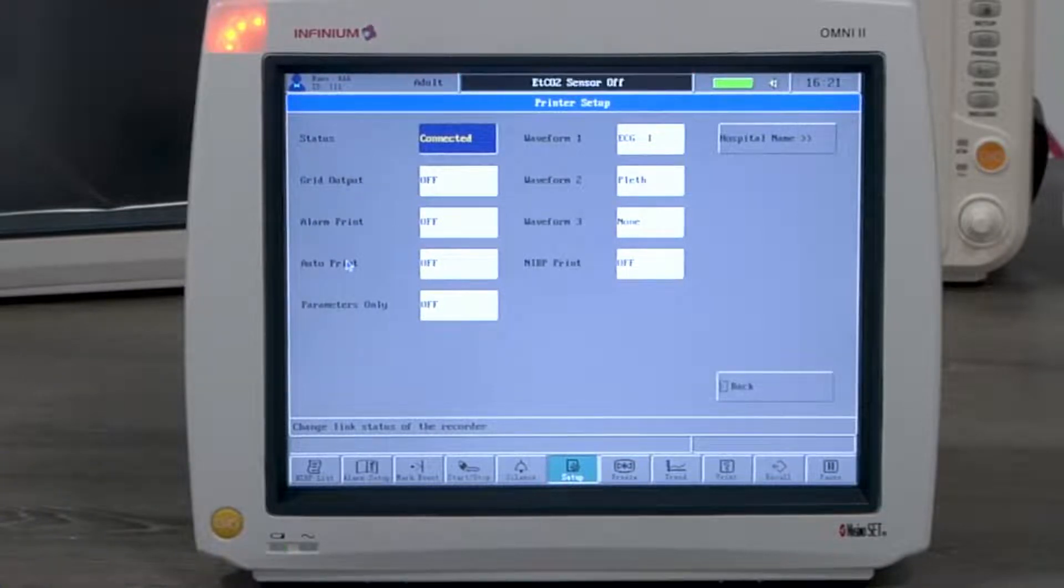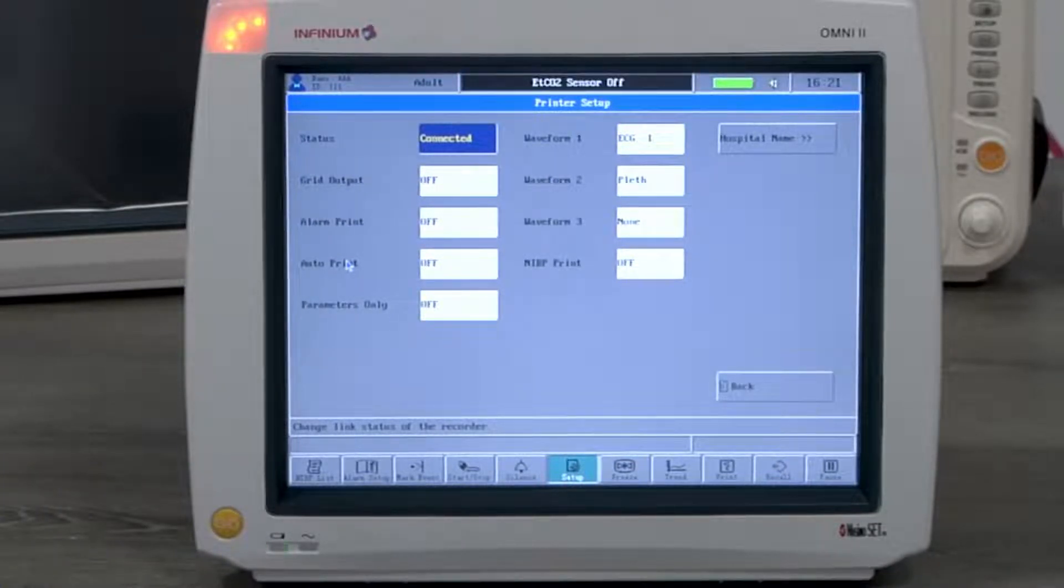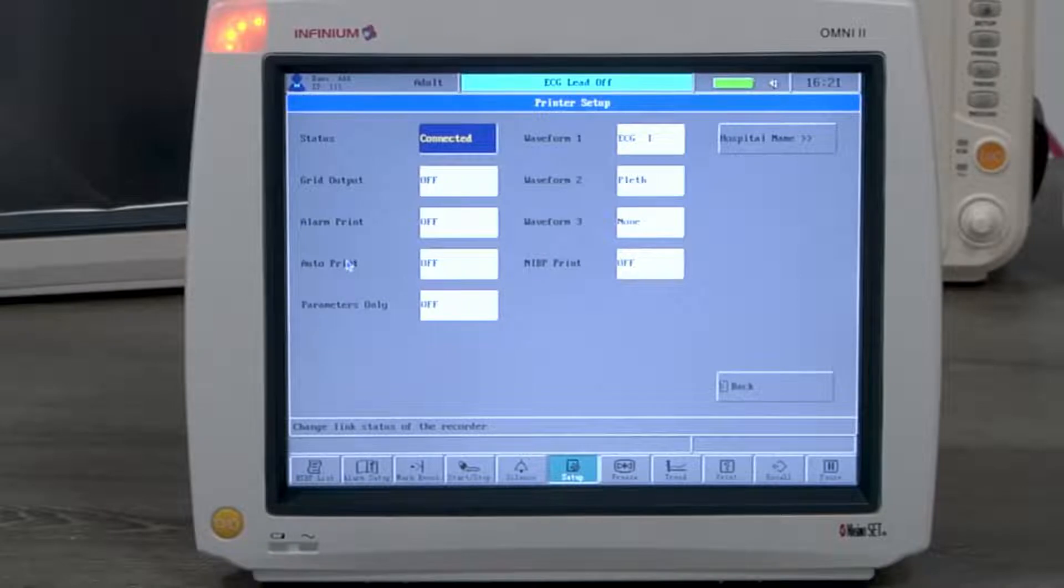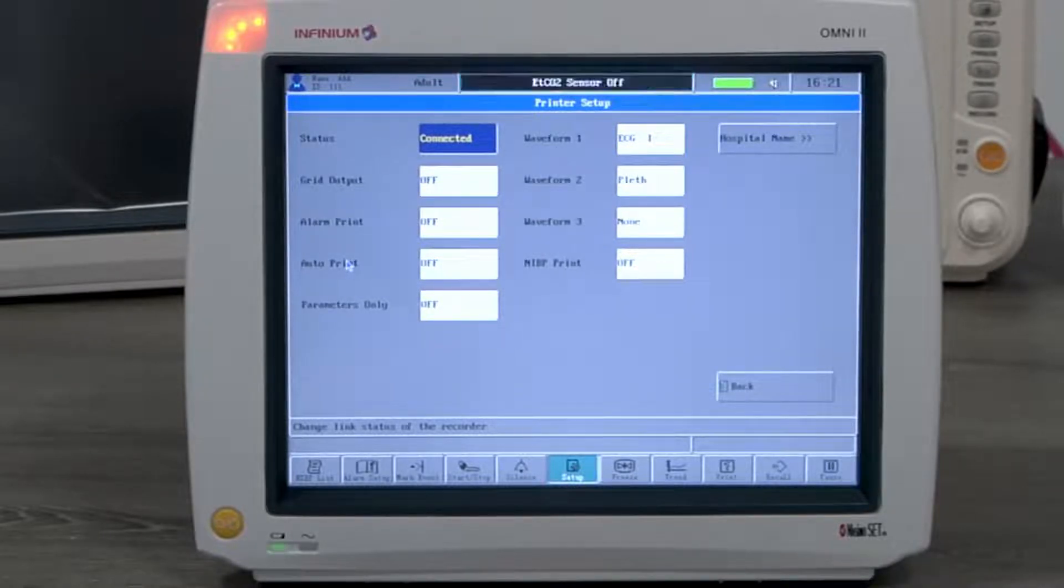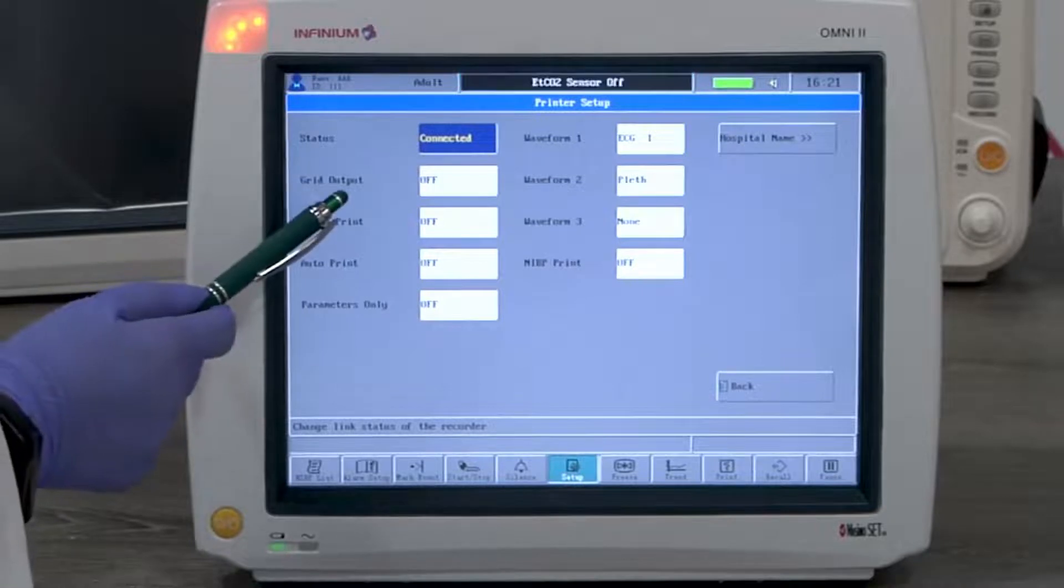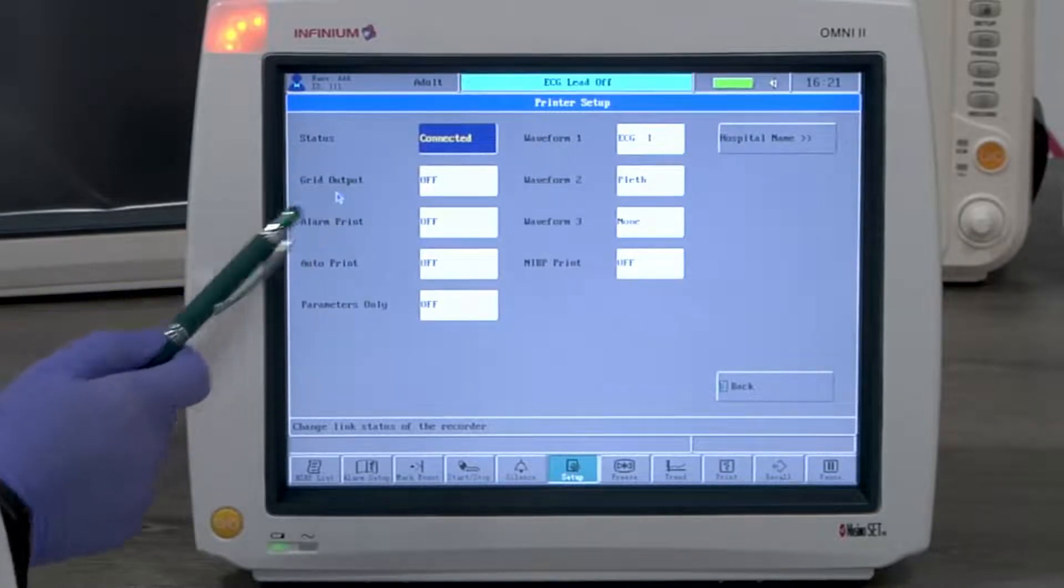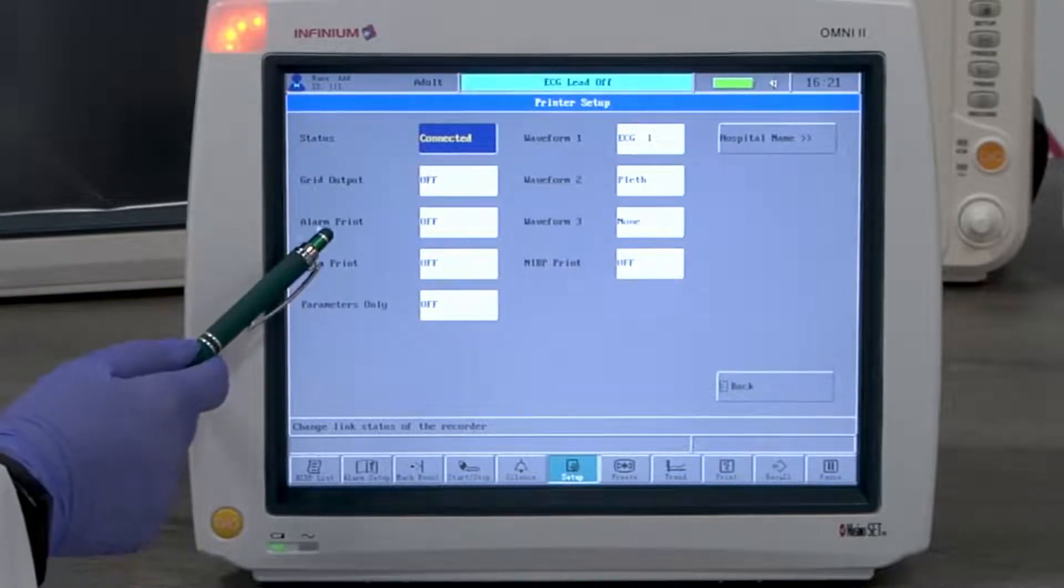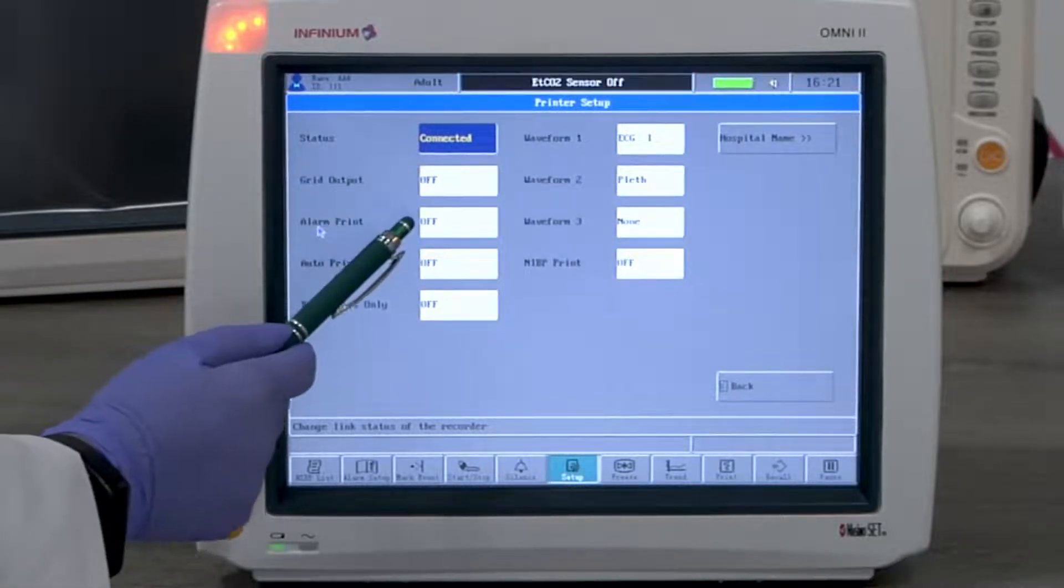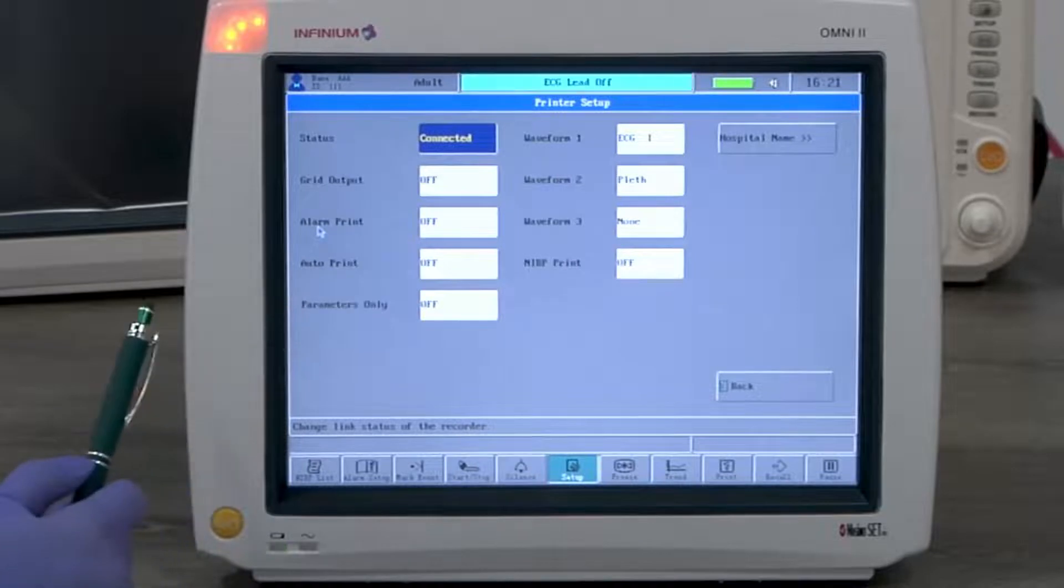Grid output, if on, puts a grid on the printed paper. Alarm print, if on, prints automatically when there is an alarm.